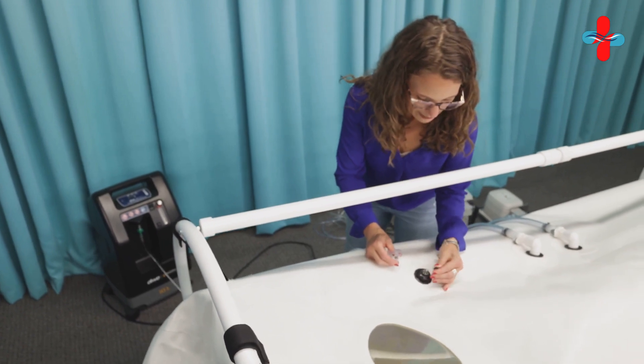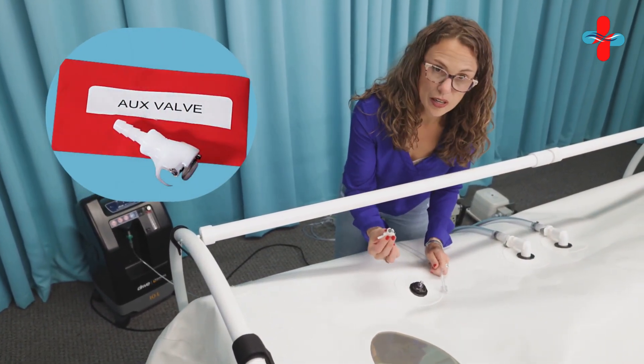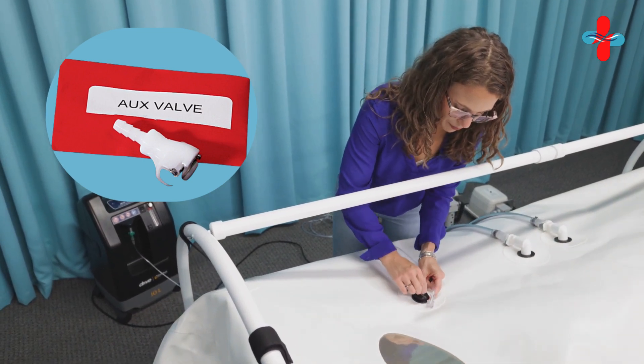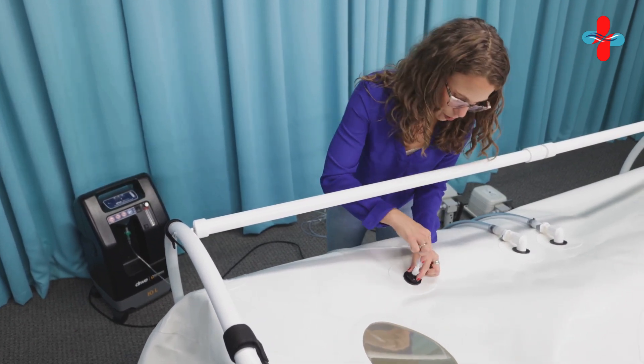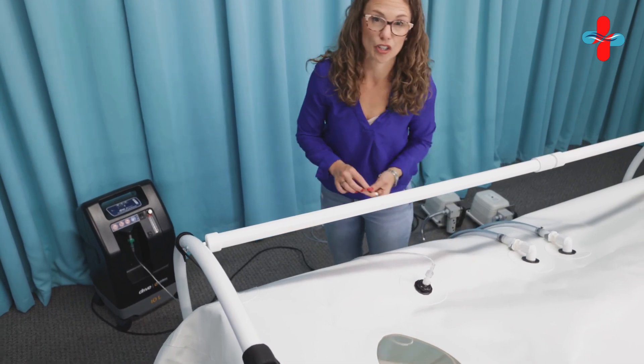You've got this little black cap here. This auxiliary valve comes in a little red envelope. You just take it, pop it right on there, and then you're taking the end of your hose and putting it right on there. And then you're good to go.